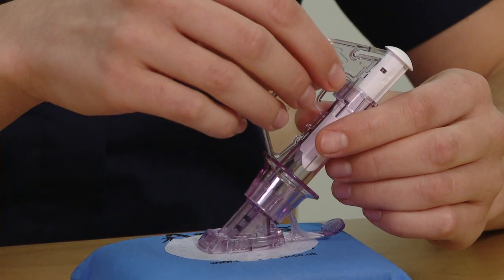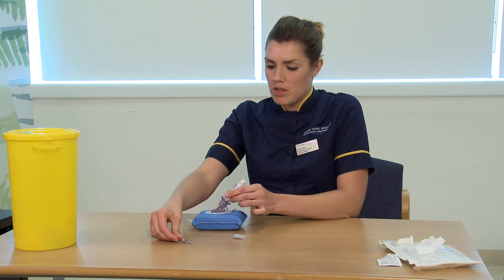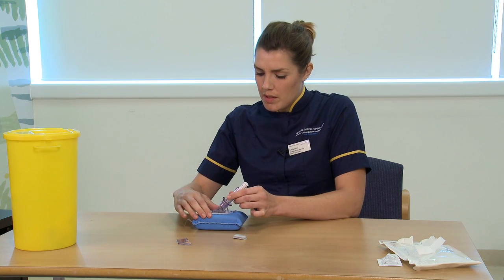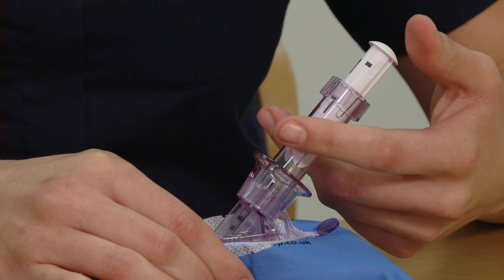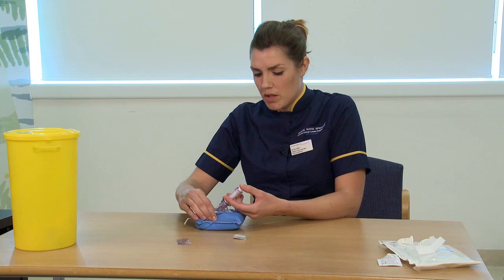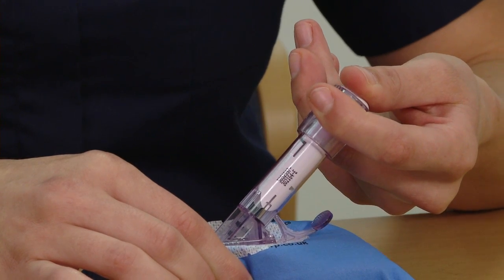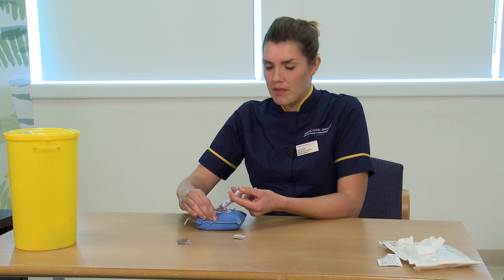Now I'm going to remove the safety guard by simply pulling it out. We're going to save this for later, as we use it to remove the transmitter at the end of the session. To insert the sensor, you need to pinch up the skin, place two fingers above the collar and your thumb on the end of the plunger. Push the plunger down and pull the collar all the way back. This can sometimes feel quite stiff but you need to pull it back as far as it goes.